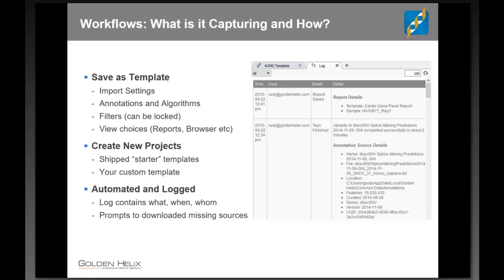If you're doing tumor normal, we have settings for that. If you're doing hereditary, we have settings for that. If you're doing cancer, we have settings for that. And then you can tweak to your heart's content and then create a template that goes into production.